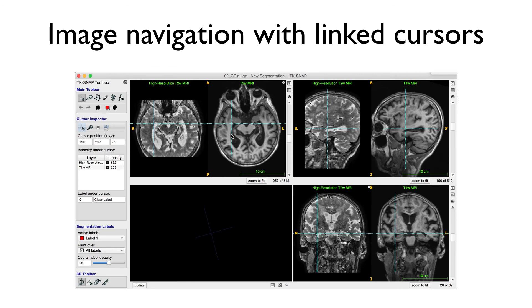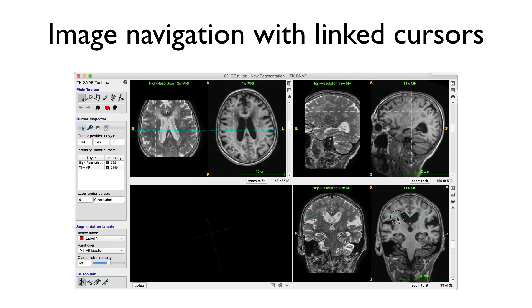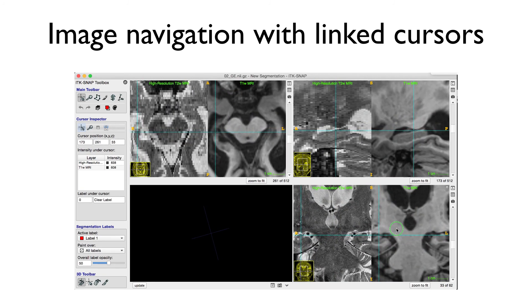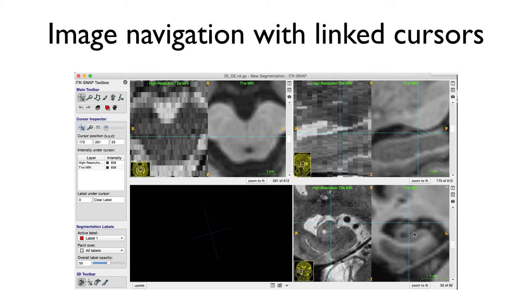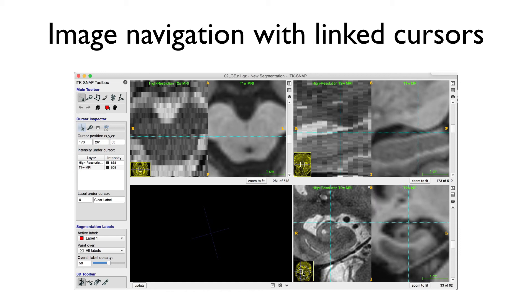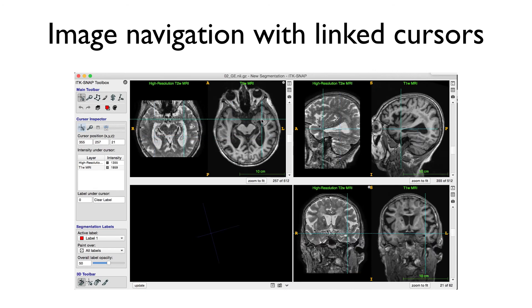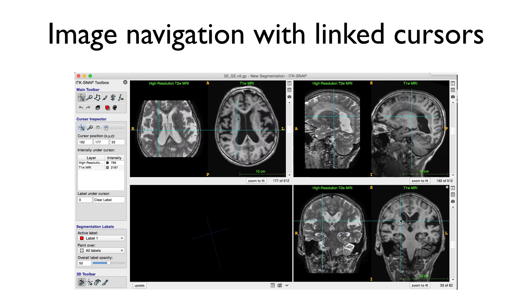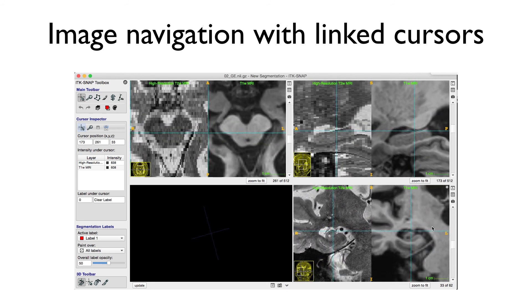Here's a little video demonstrating some of these tools in action. The user is using the crosshairs tool, clicking around in the image. As they click in one of the views, the other views also update. There's some zooming and panning going on — there's a little yellow sub-window on the lower left that you can also use to pan around. Clicking around positions the three-dimensional cursor, and you're always looking at the same voxel in all three slice views.